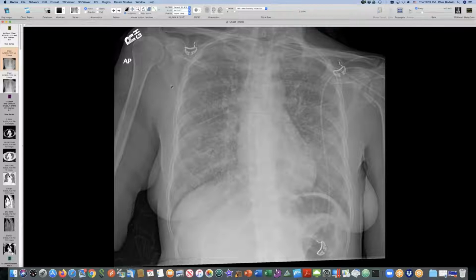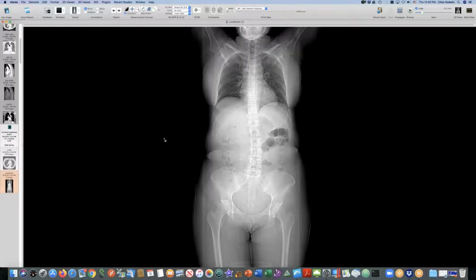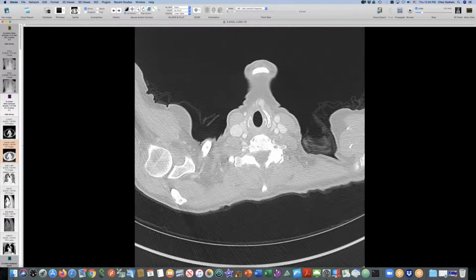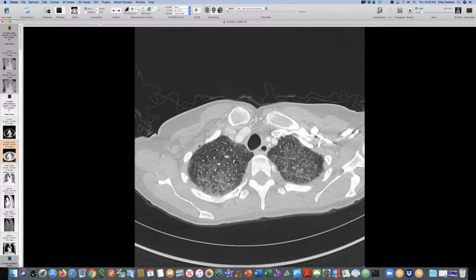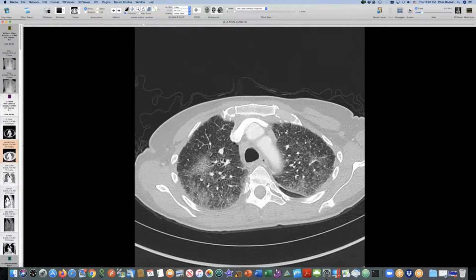This person developed diffuse lung disease. This is a melanoma patient, and it looks like a bunch of fine nodules. Melanoma is one of the tumors that's famous for miliary metastasis. I don't have an earlier radiograph, but I do have a scout view from CT, fairly ancient, to show that the lungs used to be clear. Now we've got all of this stuff. And here it is on a lung window. Seems to have a ground glass component.